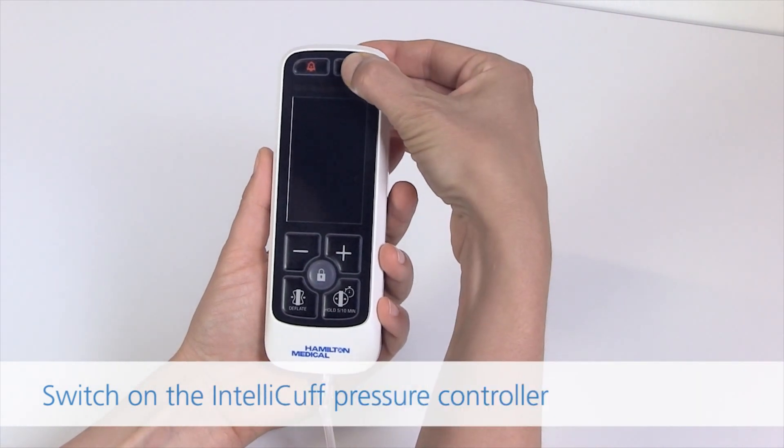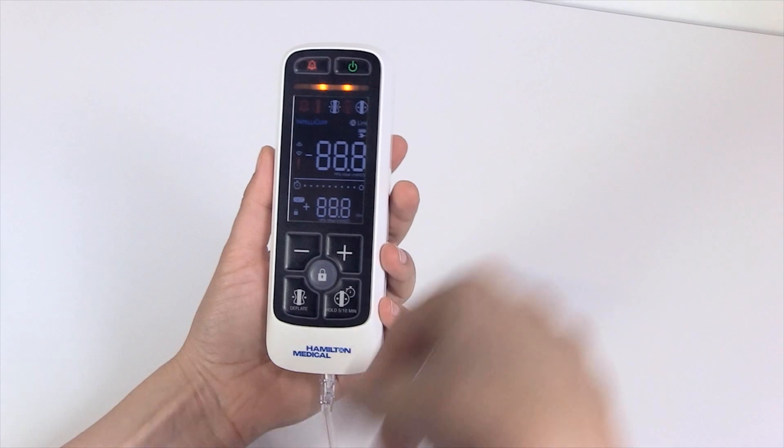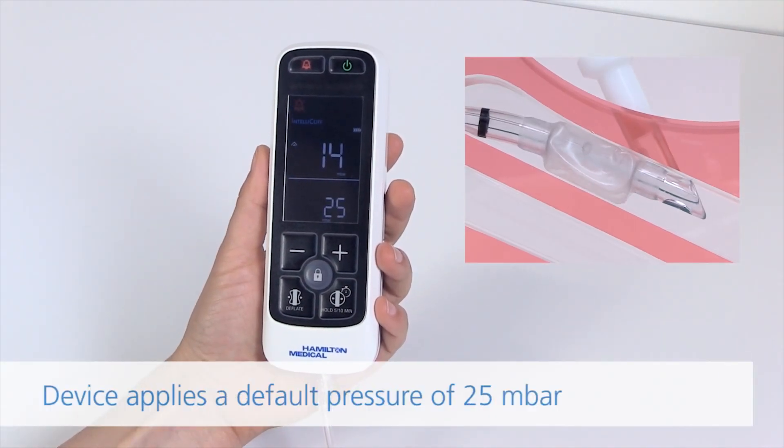Switch on the IntelliCuff pressure controller. Long press the power on/off button. The device supplies a default pressure of 25 millibars.